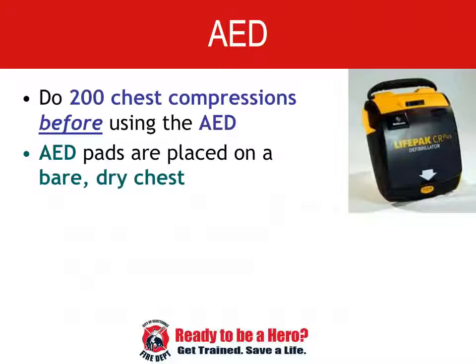The chest must be dry because water and electricity don't mix. Do not use an AED if the victim is in a puddle of water. If the chest is moist from exercise, for instance, just use the shirt or something to dry it off before sticking the pads on the chest.